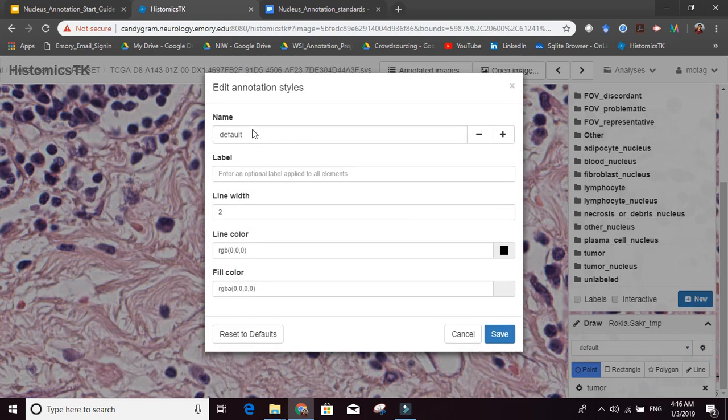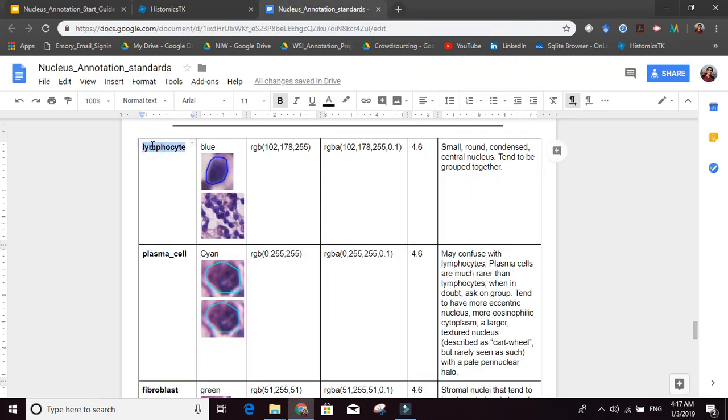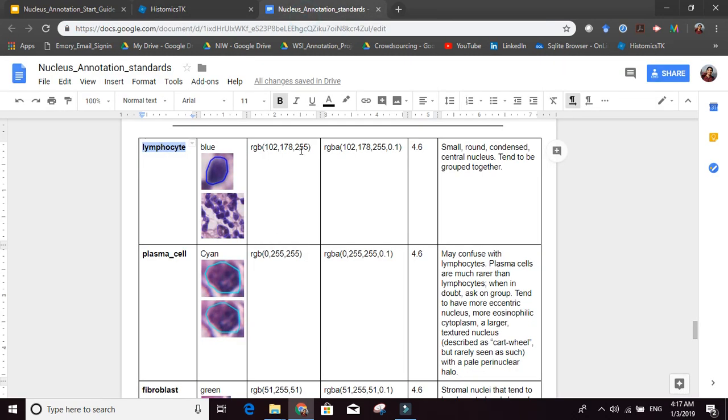Go like this. We click lymphocyte. Actually, it's better to just copy and paste it to make sure the spelling is exactly correct. The line width is 4.6, and this is the fill color.